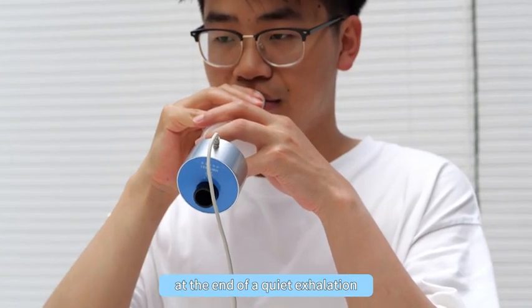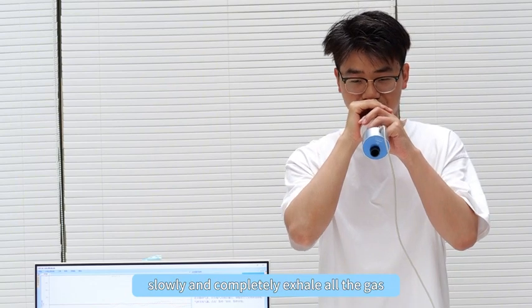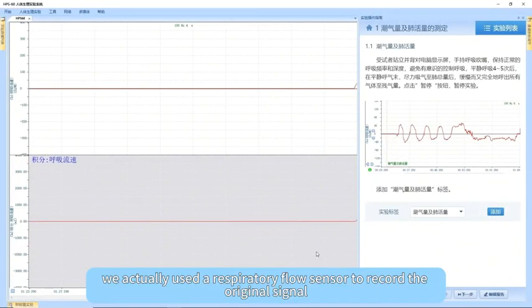At the end of a quiet exhalation, try to inhale to total lung volume. Slowly and completely exhale all the gas. Residual volume. In this experiment, we actually used a respiratory flow sensor to record the original signal.